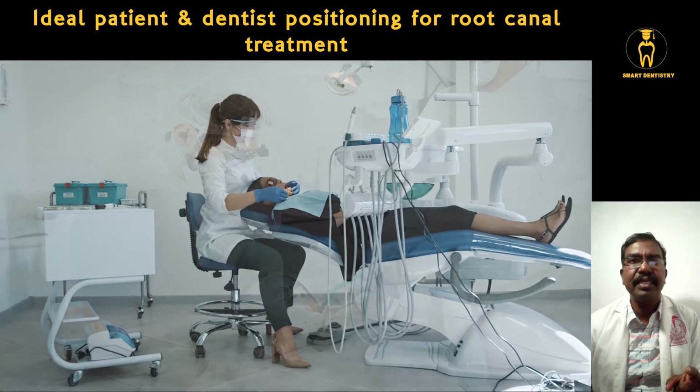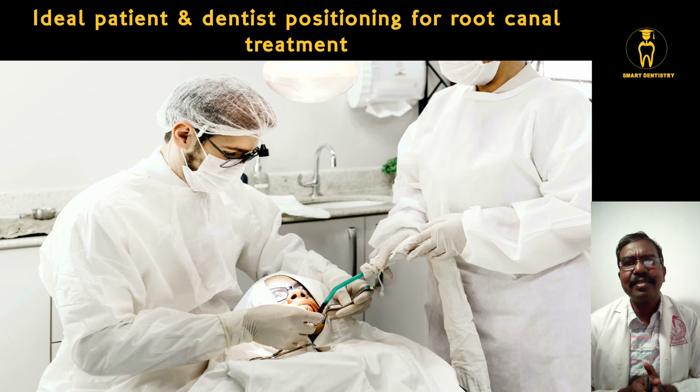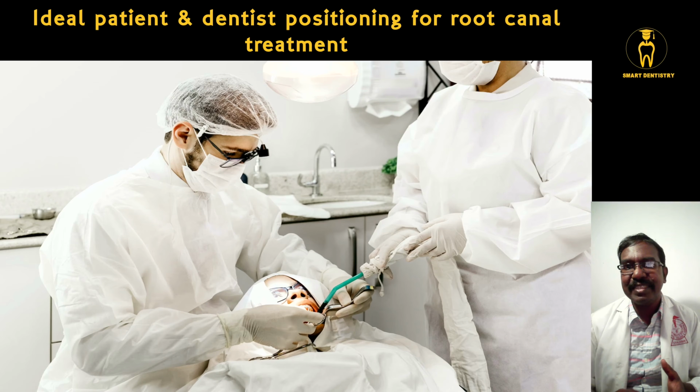Okay, the next one that I would like to suggest is always position yourself in the 11 o'clock position. Why this 11 o'clock? Is it possible to approach all the quadrants of the teeth sitting from the 11 o'clock position? Yes, it is possible. Try it out.